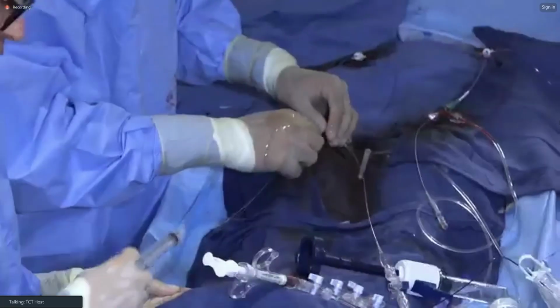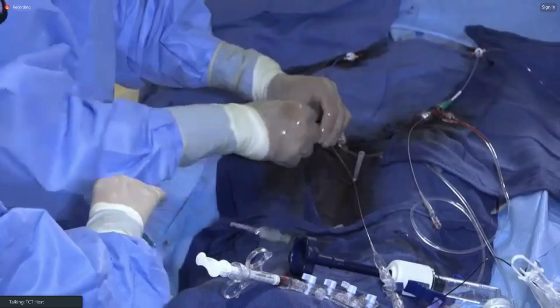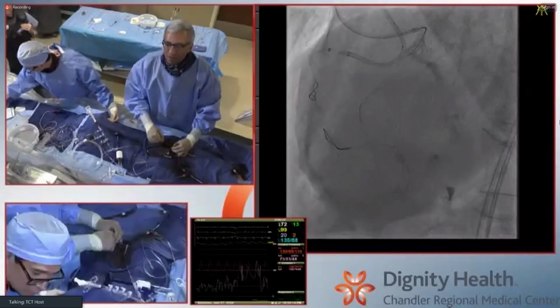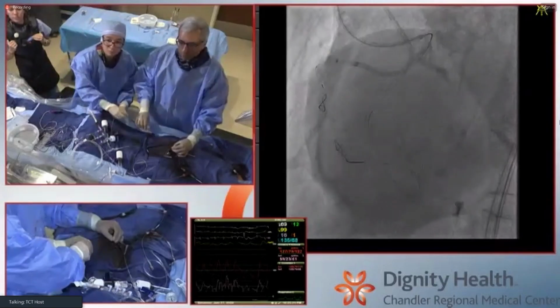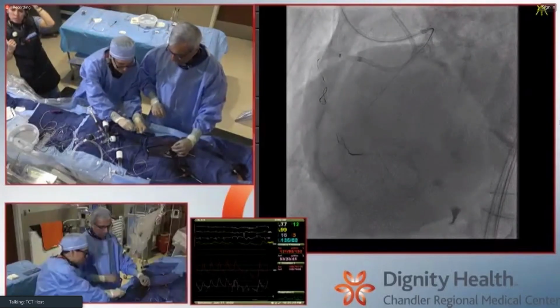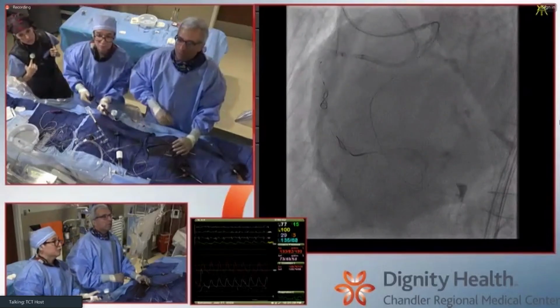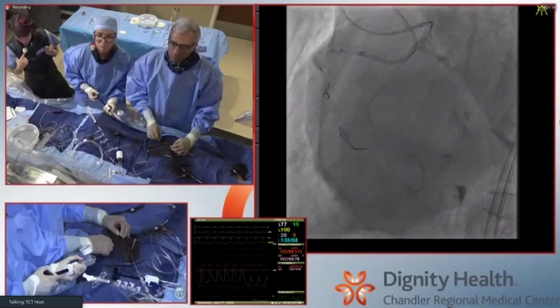Anybody have any other approaches in terms of retrograde or reverse CART wire? Is everybody going with a penetrative, directed wire? Once you're already in, is this a 3.5? You gain a high tip load, so Gaia next. To tell you the truth, I don't know. This maybe is just my approach to these things.